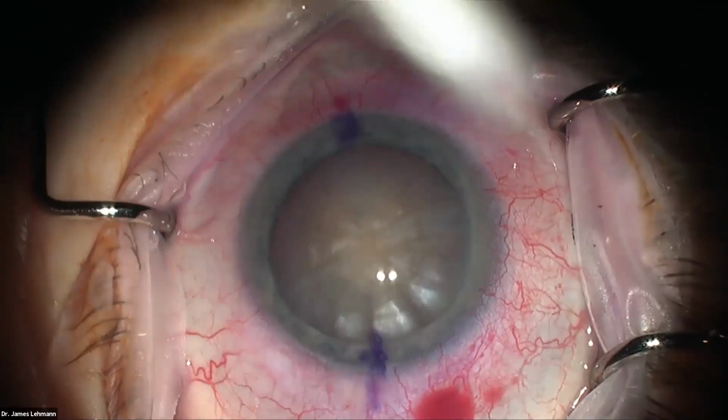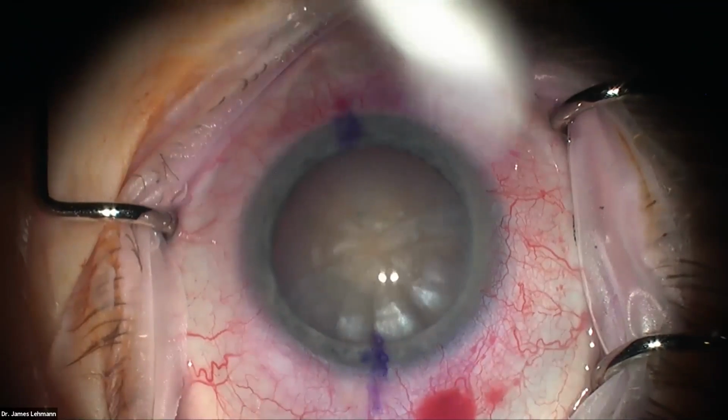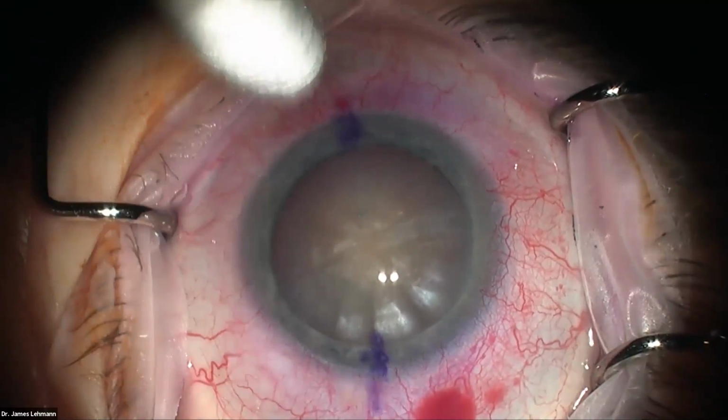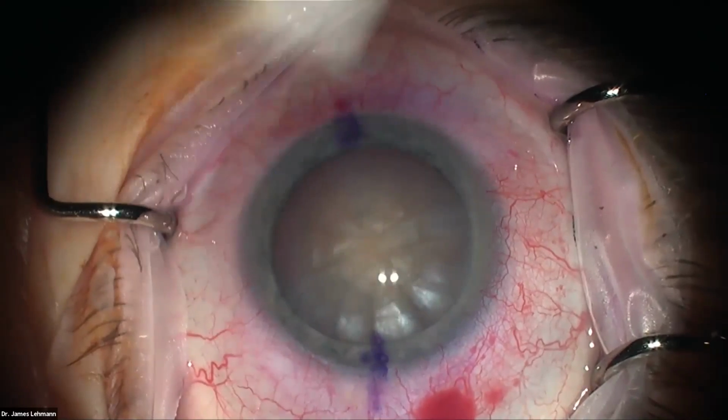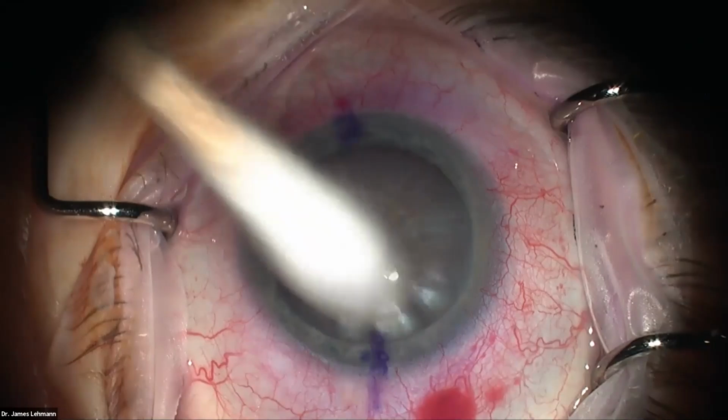Most of the time, the iris registration is great on the LENSAR, but in this patient, it wasn't working. I think it had to do with not being able to see the iris in contrast with the lens, and so we put marks and did one little AK here at 180.